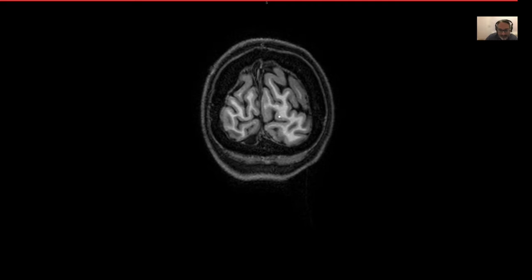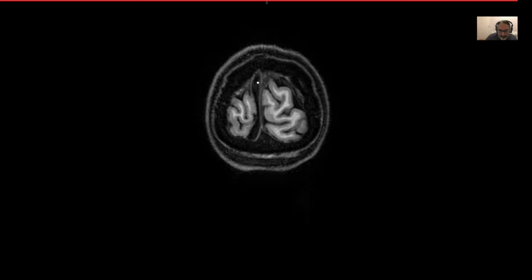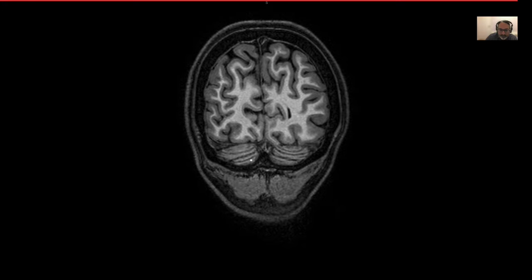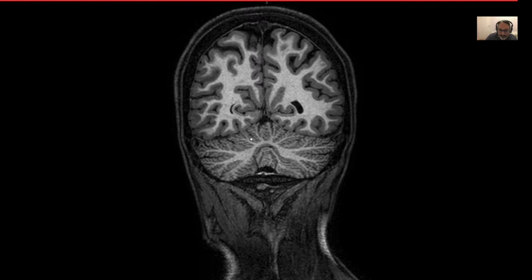So let's go from the posterior all the way to the anterior. And so you've got the superior sagittal sinus coming down, moving inferiorly. That's the occipital lobe. That's the cerebellum that's showing up on both sides. The cerebellum is, as you can see, getting larger.